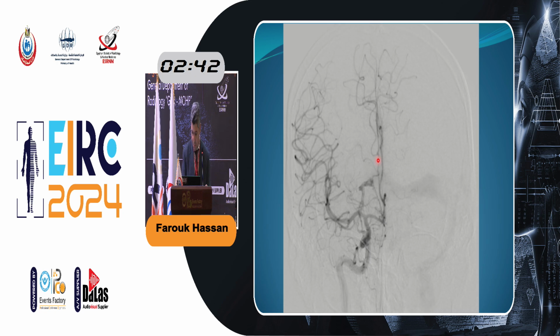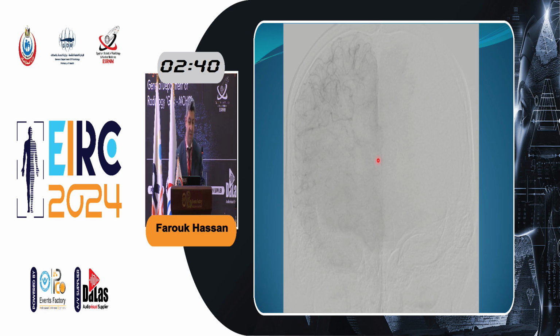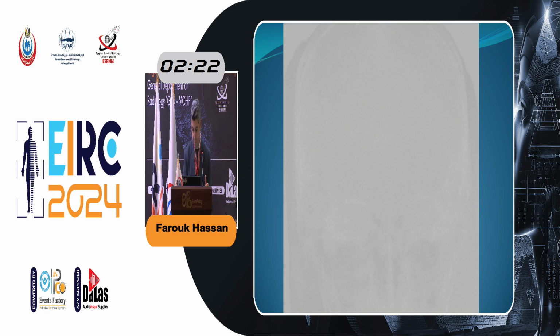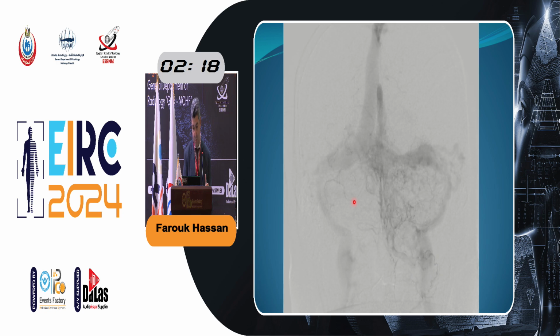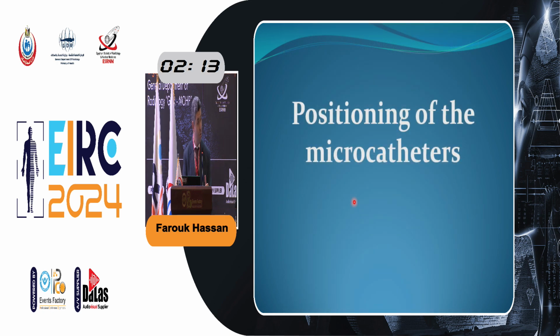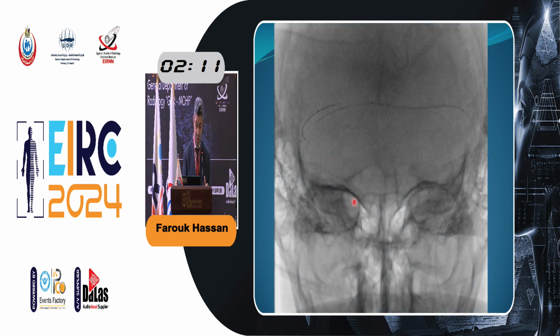And we made sure in the very delayed venous phase, we have to check the venous phase of the internal carotid and the vertebrobasilar system. We make sure that the sinus is not functioning, neither the torcula nor the proximal parts of the transverse sinus, as we can see here. So we have venous rerouting. And this is the vertebrobasilar system, so it's a huge fistula. I don't think that we have any option other than occluding the whole fistulized pouches of the sinuses.